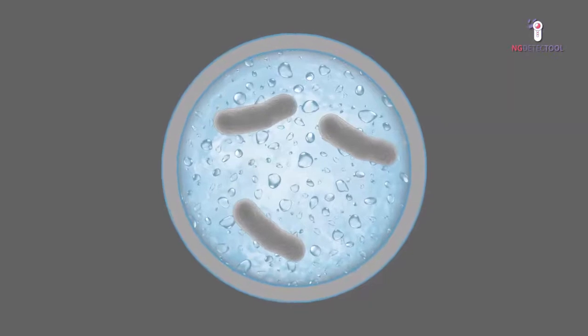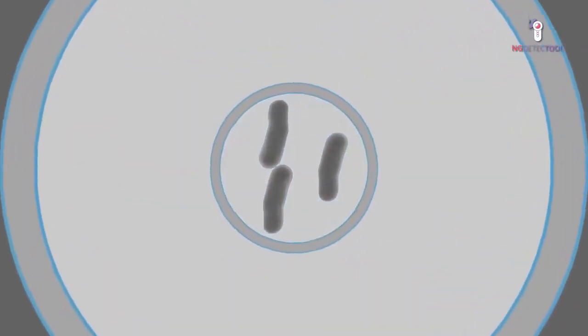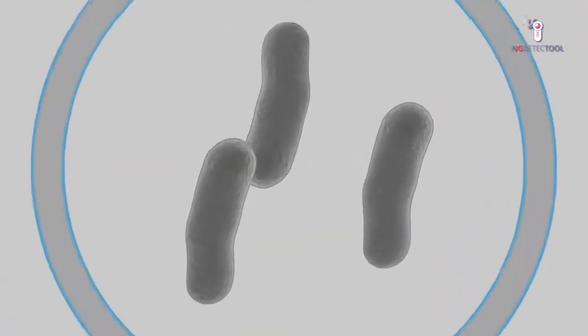This device concentrates bacteria from liquid samples and eliminates the interferences due to the biological media, therefore improving the sensitivity. Thanks to this system, the detection of multi-drug resistant bacteria is considerably simplified and shortened.